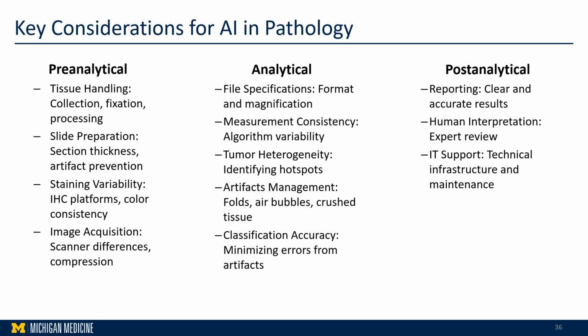I would like to emphasize and share with you what might go wrong, although I shared with you all the things that are really promising from machine learning and AI. For surgical pathology, the whole slide image is only as good as the glass slide from which it came from the lab.